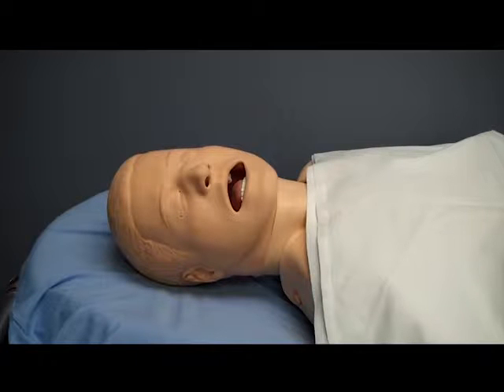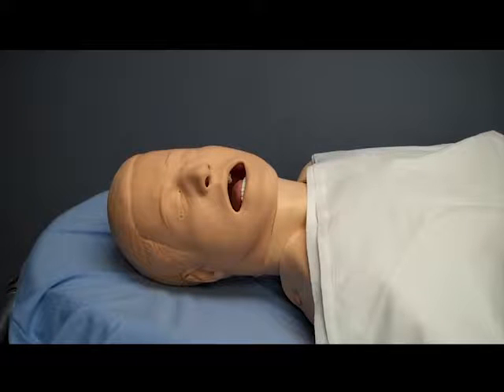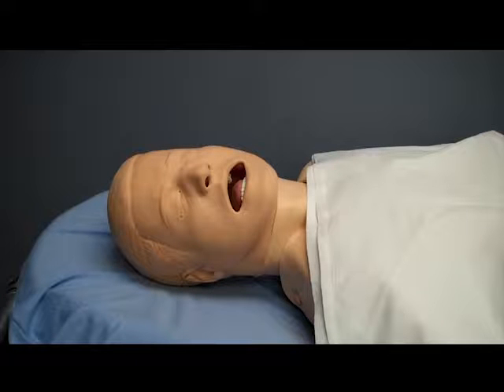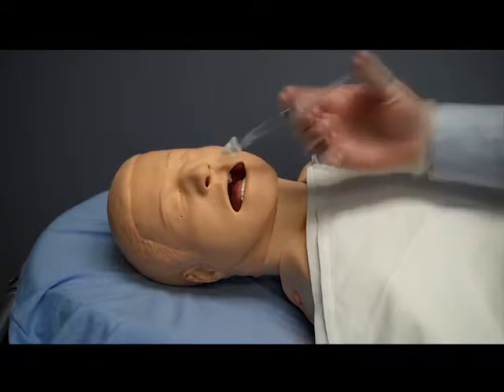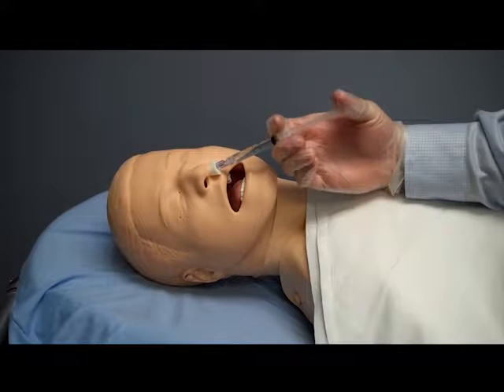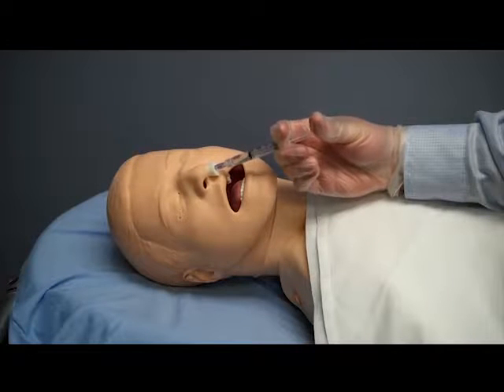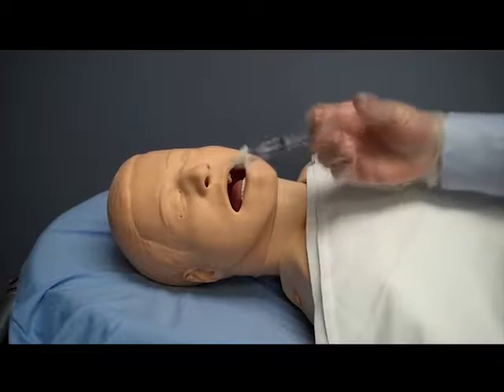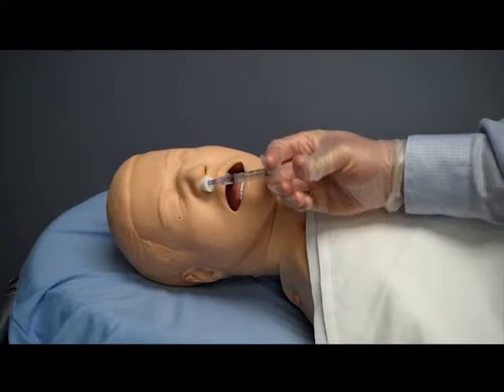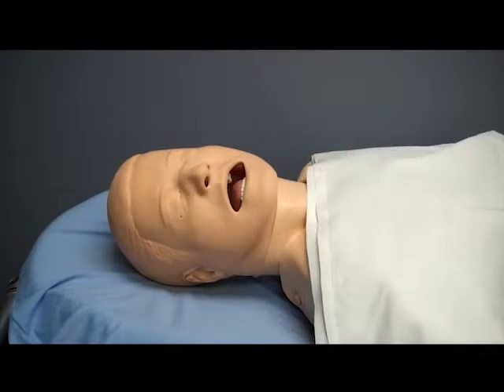Next, we will insert the atomizer into the nostril and administer the medication in a fast-push manner. This will force the medication through the atomizer, creating a fine mist inside the nostril and improving absorption. Generally, we do not want to administer more than one milliliter per nare.